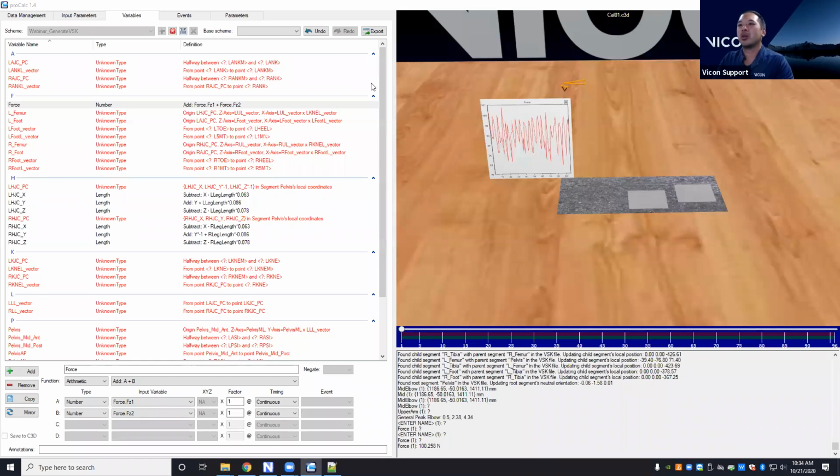Okay, so if you only have 2 points, unfortunately, you won't be able to really define a segment because we won't know the orientation of that vector. So you're going to need at least 3 points. But definitely, they can be going from A to B, and B can be a midpoint.